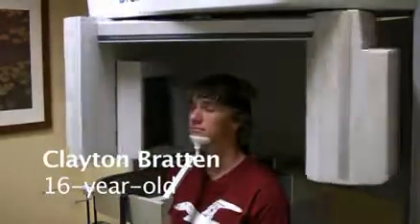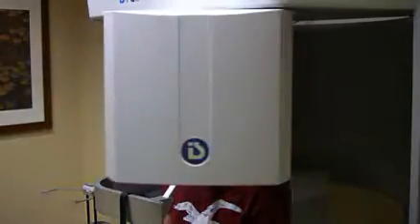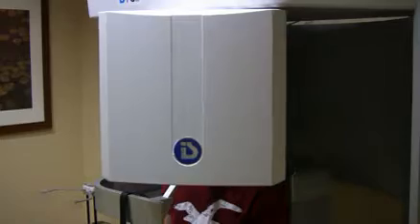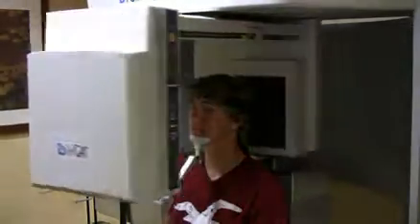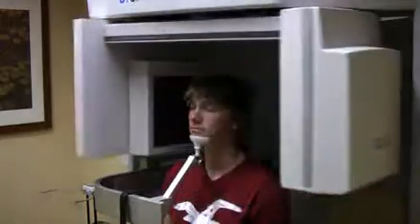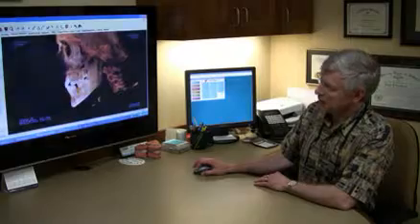With a two-dimensional X-ray, we're looking at a three-dimensional object with items overlaid on each other. And with a three-dimensional X-ray, we're able to look at each individual item of interest without any interference or overlay of any additional tissues. And again, being able to look at something from any angle is really quite helpful.